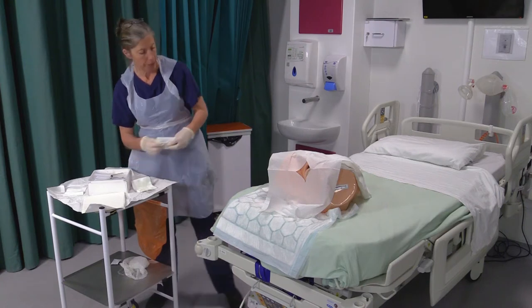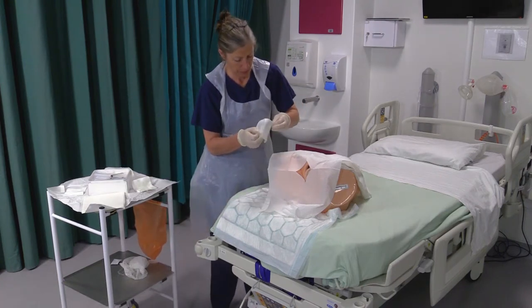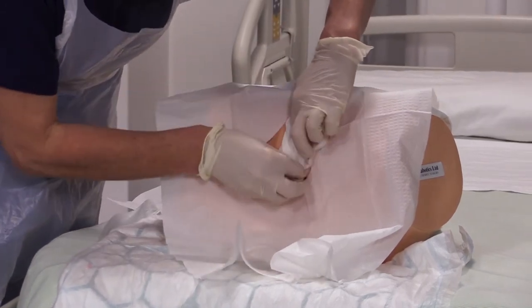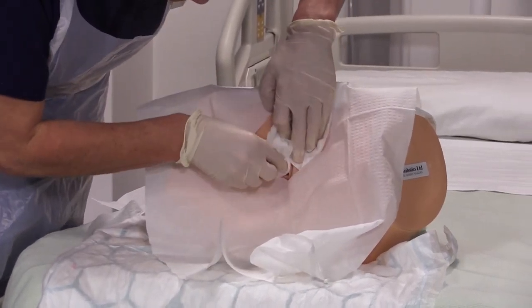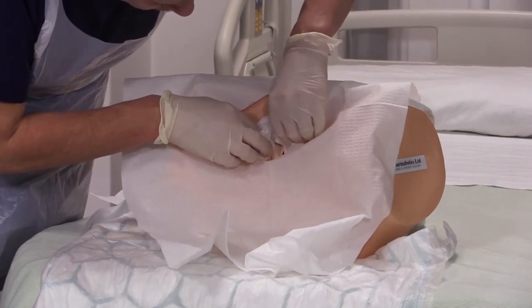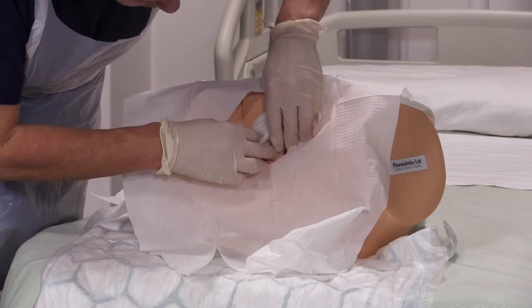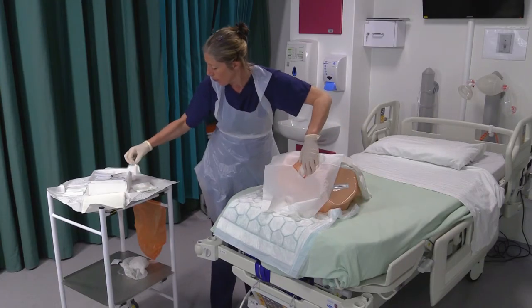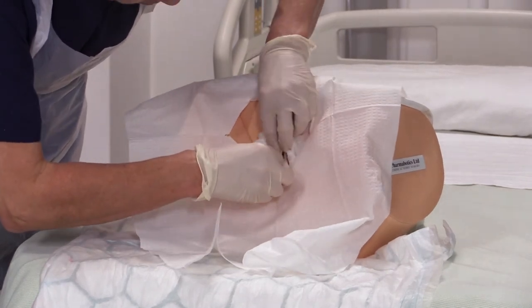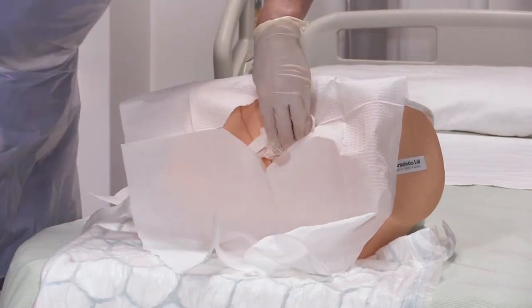Now separate the labia minora using a swab in order to view the urethral meatus. Select the cleaning agent according to local policy and clean the labia and urethral meatus with downward strokes using single swabs. This will lower the risk of contaminating the urethral meatus with bowel flora.